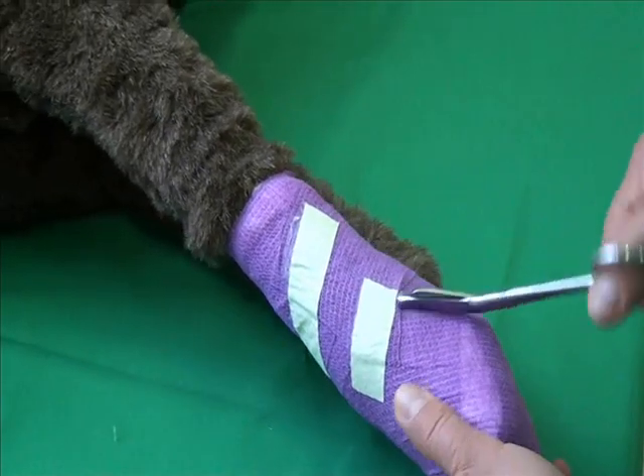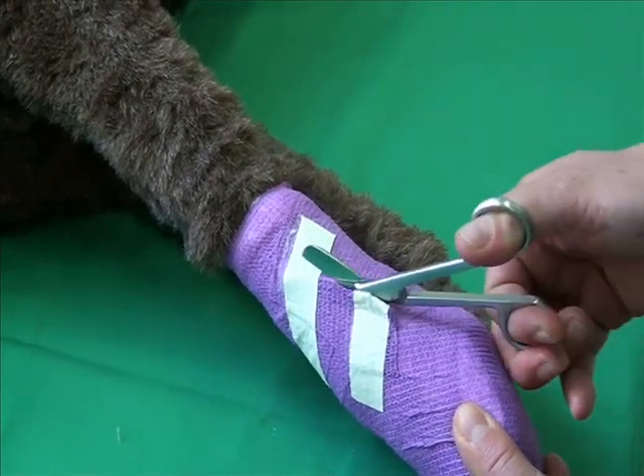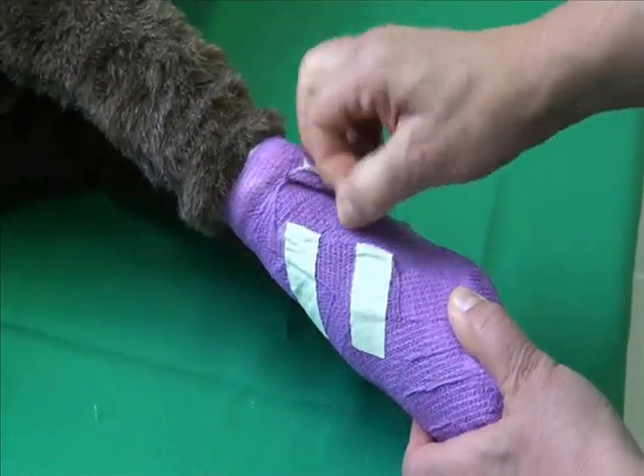Finally, how to remove the bandage is demonstrated. In the real animal, the dressing can be opened using dressing scissors. In the skills lab, please remove the plaster strips by hand, so that the bandage can be reused.